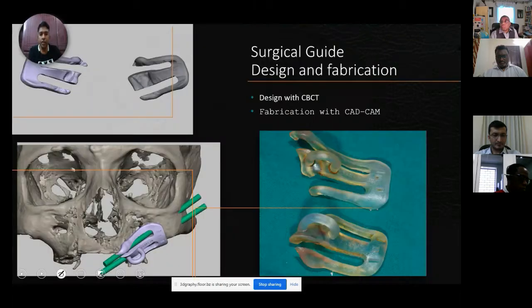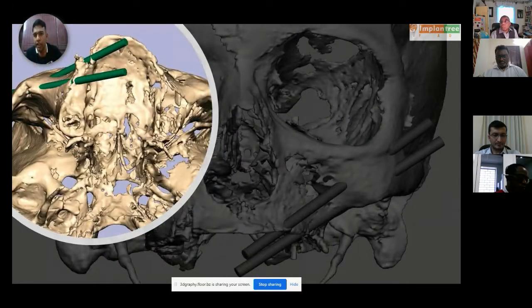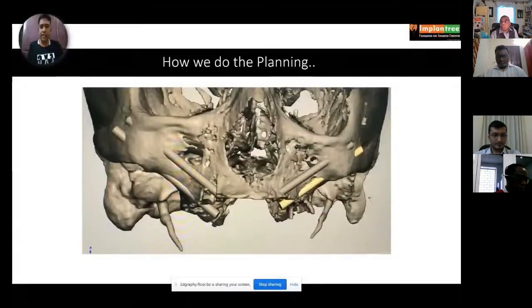So this is the implant planning level, how we position the implants, and I see the anterior-posterior positioning, how deep in the pad it has to go. All this planning I can do over TeamViewer. And sometimes I just like to go sit with Arjun and John in his office, do some discussions, see things. So this is how we do the planning.